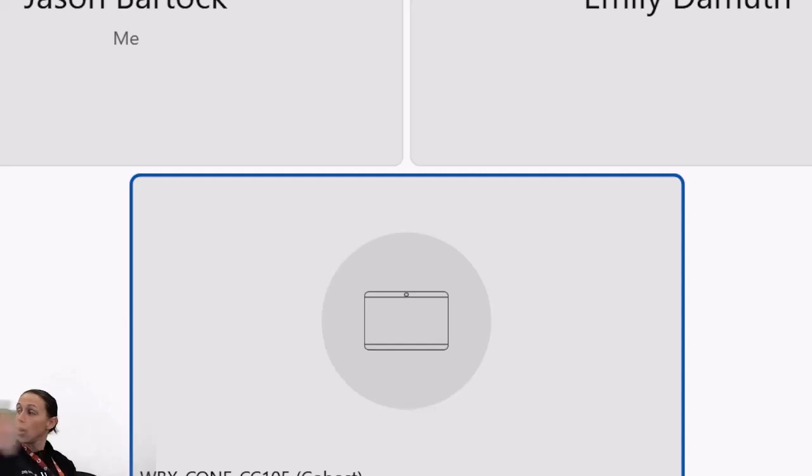There was a patient that Haney and Mike put on, coach. They talk about the role of Lucas with that. We started doing that during COVID to use the Lucas so that they could cannulate the patient for VA ECMO. I think the challenge is the availability. Some of our providers have the skill set to arterial cannulate. Many of us are not super comfortable with that, and that's historically, at Cooper and almost everywhere in the country, something a surgeon does.